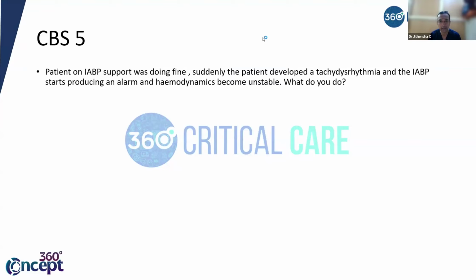So already have some answers. Put on auto mode, change the trigger. Yes. What trigger do you want to change to? Auto mode, yes. Anybody else? Any other specific trigger you want to put to? Pressure trigger, auto mode, defibrillator, pressure trigger, auto mode, yes. AF trigger, yes. So you can put to AF trigger.